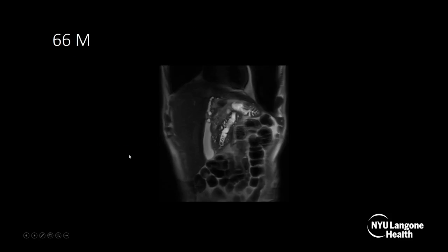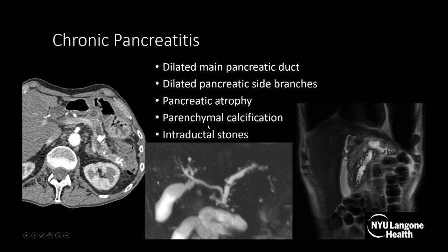Now we'll move on to chronic pancreatitis. This is a 66-year-old male on a coronal HASTE — essentially T2-weighted. You can see the main pancreatic duct is dilated with T2-dark filling defects, which are intraductal stones, and dilated side branches — findings of chronic pancreatitis. On axial CT with IV and neutral oral contrast in another patient, you can see parenchymal atrophy, intraductal stones, and pancreatic parenchymal calcifications as well.